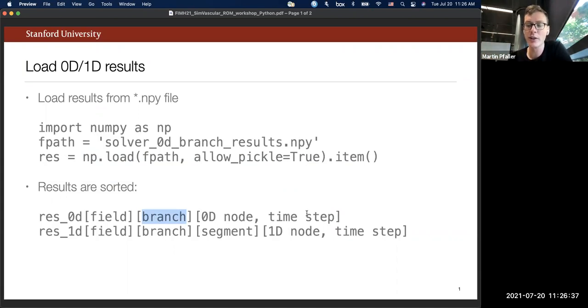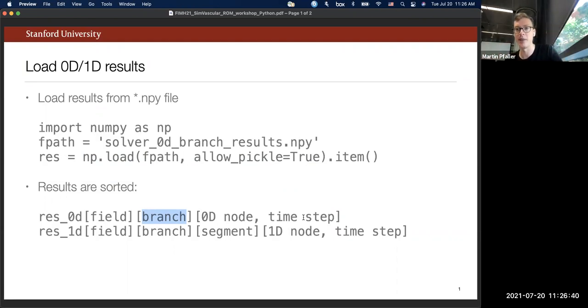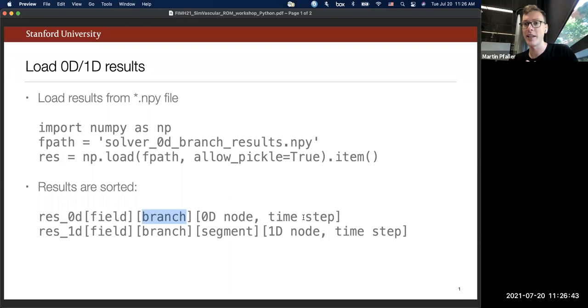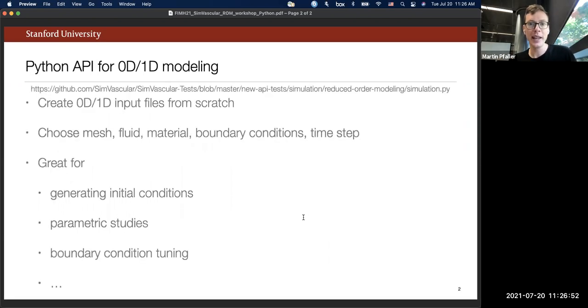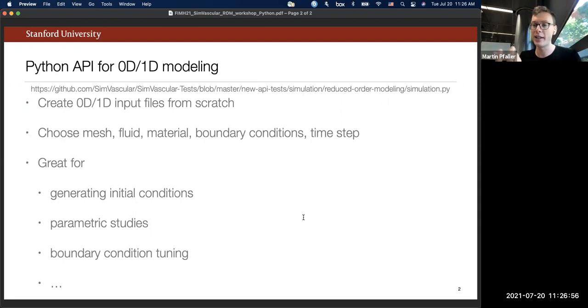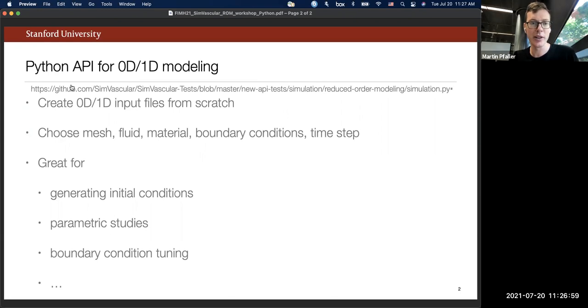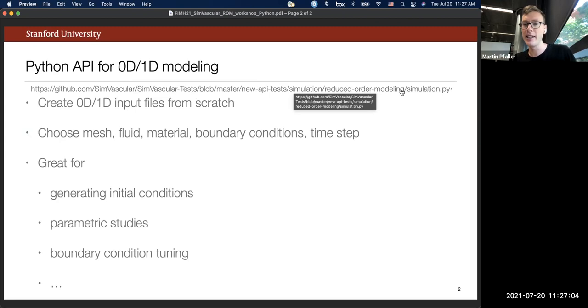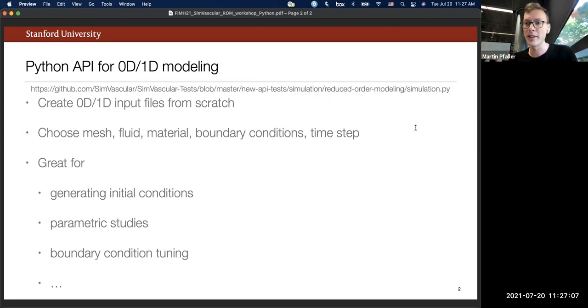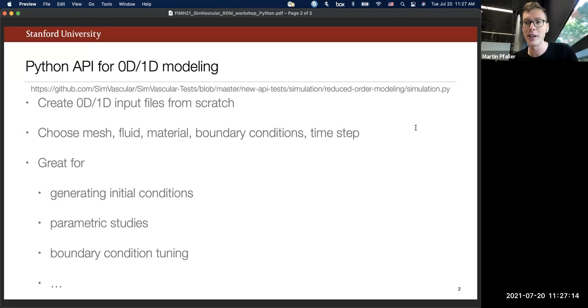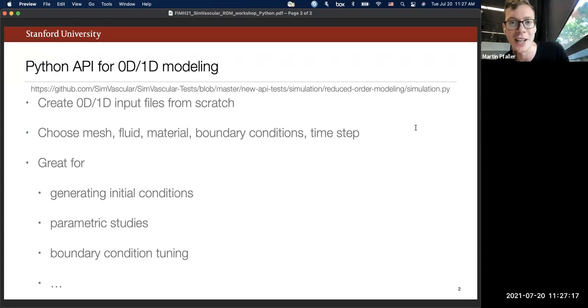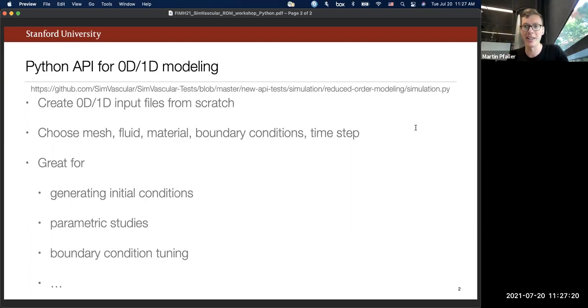And then they are sorted by the physical branch in your model according to the centerline. And then for each 0D node and for each time step you have a two-dimensional NumPy array. And so you could use that, for example, let's say you want to tune boundary conditions, you could use that to automatically extract the results and feed them back into your optimization loop. And we also have a workflow of automatically creating and running those reduced order simulations. So if you go on GitHub, Dave has a repository called SimVascular Tests, and he includes an example of how you can use SimVascular Python to automatically generate those models. So again, this would be something that you could use, for example, in a boundary condition tuning approach or for uncertainty quantification or any other applications that you can think of.